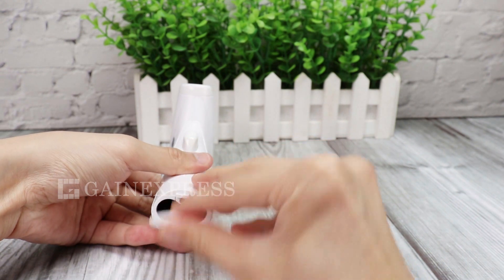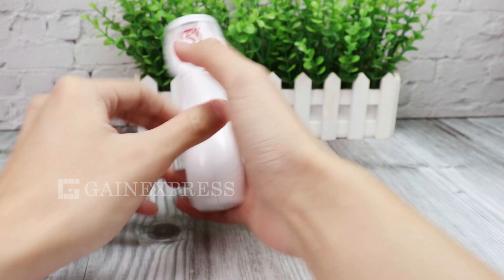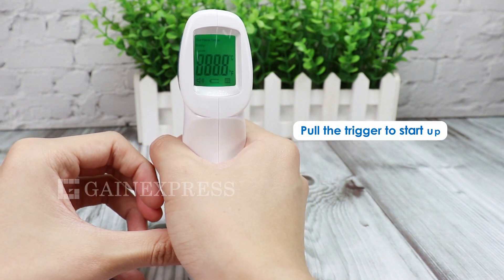To operate, open the battery cover and load two AA batteries. Make sure to install the batteries in the correct position. Pull the trigger to start up the meter.